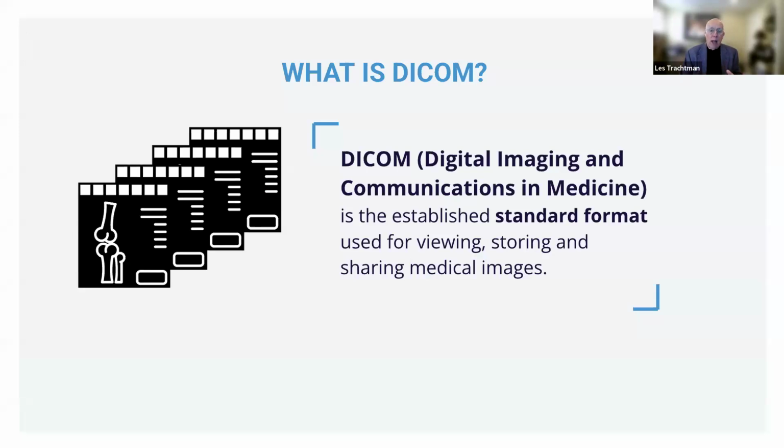The nicest part about radiology or radiological images is that 99.9% of them are in DICOM format, which means that if you have a good DICOM viewer, and you're going to need a specialized viewer to see DICOM, it can look at any type of DICOM, and that ranges all the way from X-rays to ultrasounds to nuclear to CTs, MRs, anything that you've ever heard of. Those are all DICOM, and they all show up in a good viewer.